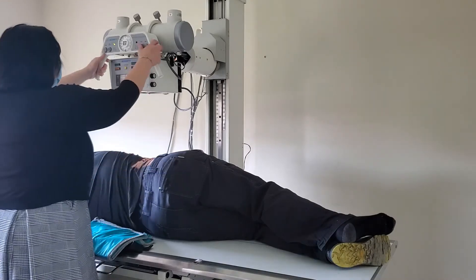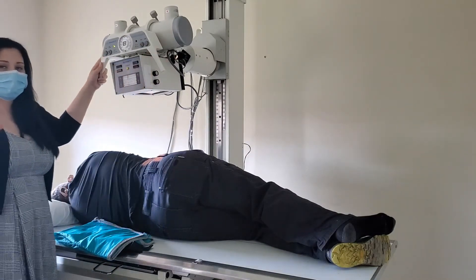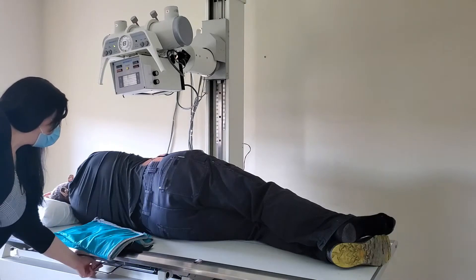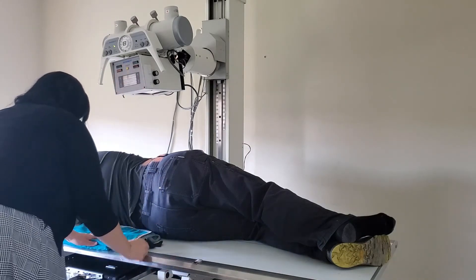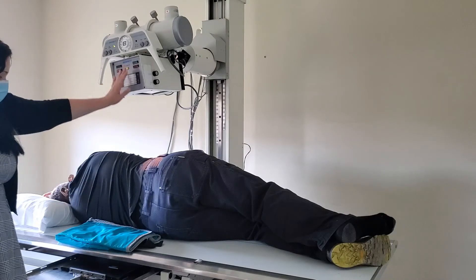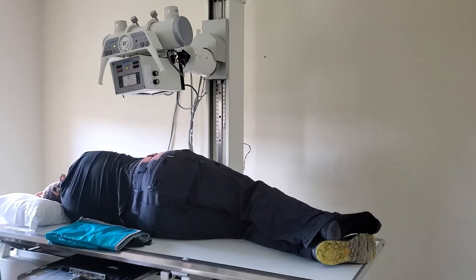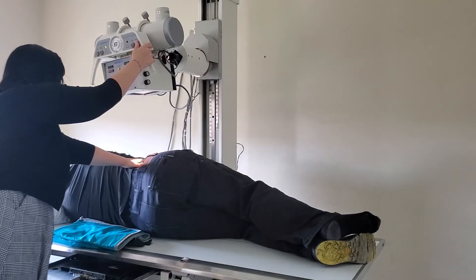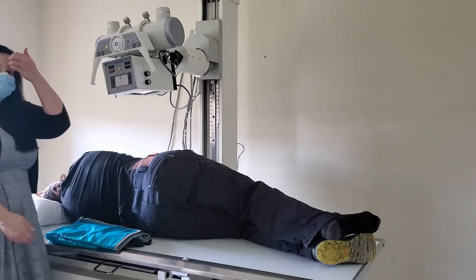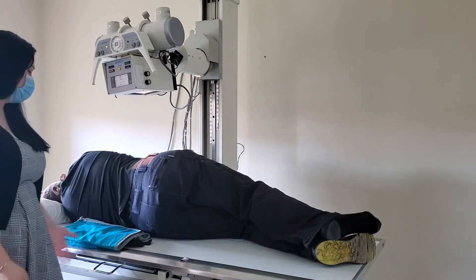If I put a five degree caudal angle on the tube, the most important thing is — after changing the direction of the CR — immediately go down to your bucky and make sure you're still aligned. If everything isn't centered, you'll have limited up-and-down movement. In that case, you'd need to move the patient up, then recenter and realign the bucky and tube. It's much better to start your cassette tray in the center of the patient so you have more wiggle room.